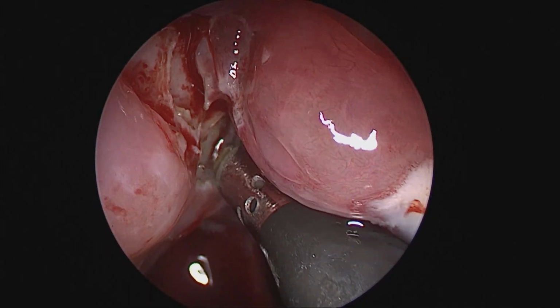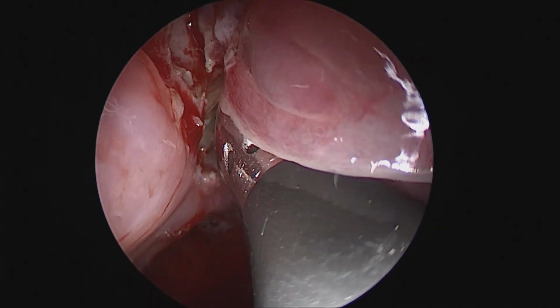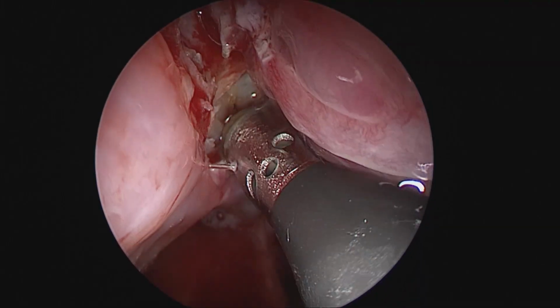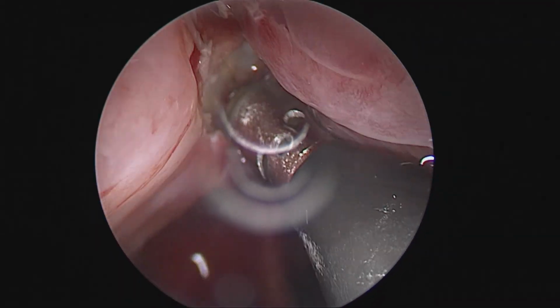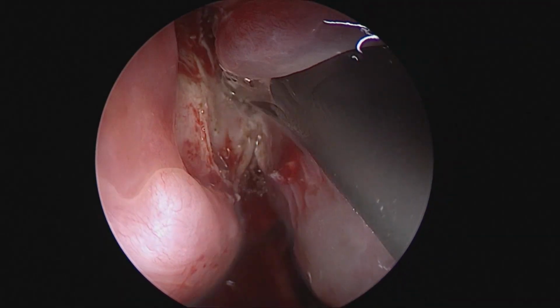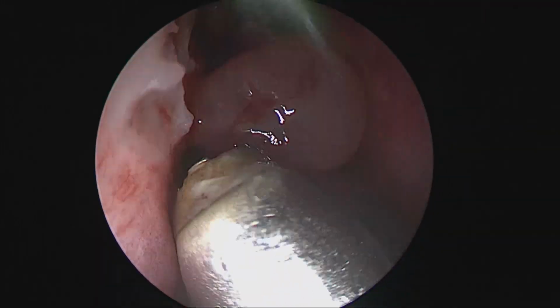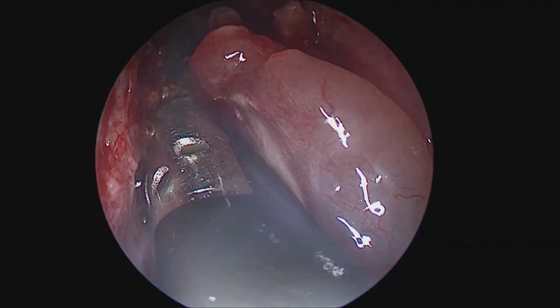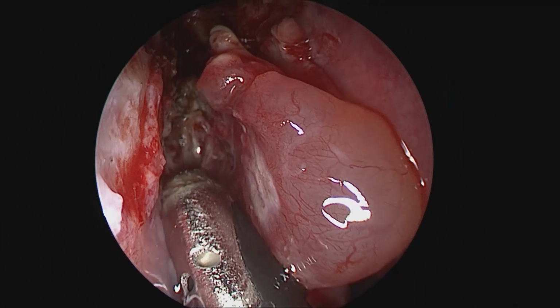to be able to progressively get this tumor specimen out, if it permits, in a single block, or at least in a large block, because large blocks are easier to be evaluated by the pathologist, and any evidence of dysplasia or malignancy changes are far better appreciated in a larger block as compared to small shreds of tissue, which may or may not be representative in terms of a definitive final histopathology specimen.